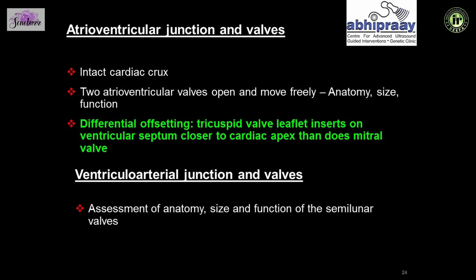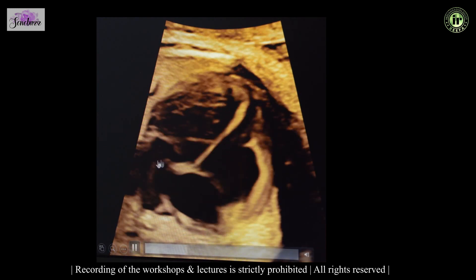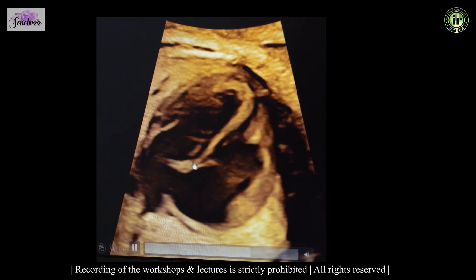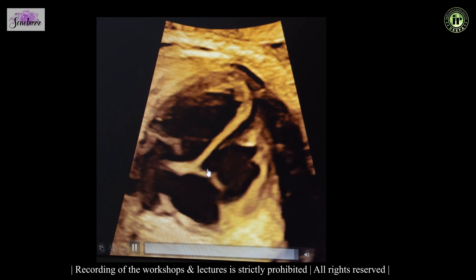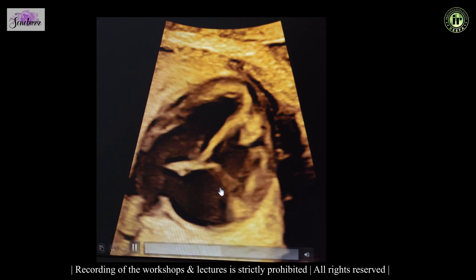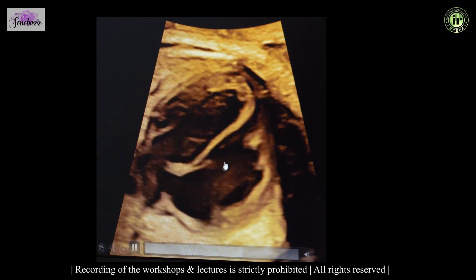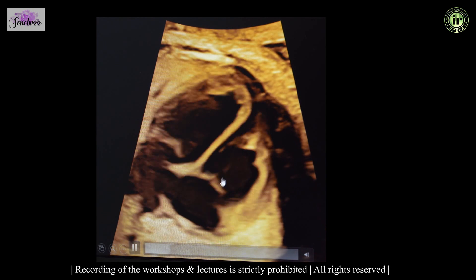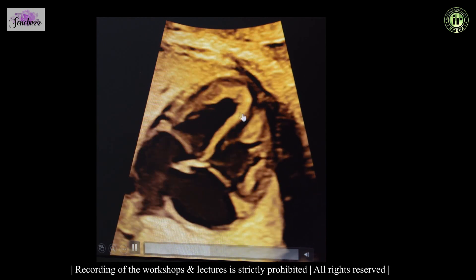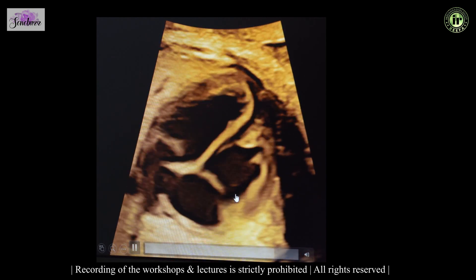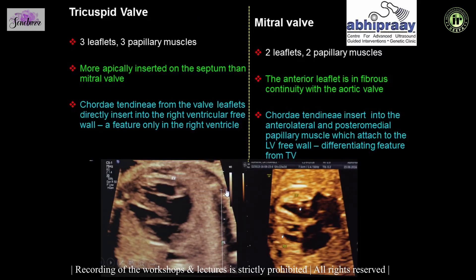Looking at the AV junctional valves and semilunar valves, you appreciate the offsetting — the tricuspid is more apically placed than the mitral. You should be able to see good movement — opening and closing of the valves — which denotes the anatomy and function of the ipsilateral chambers.